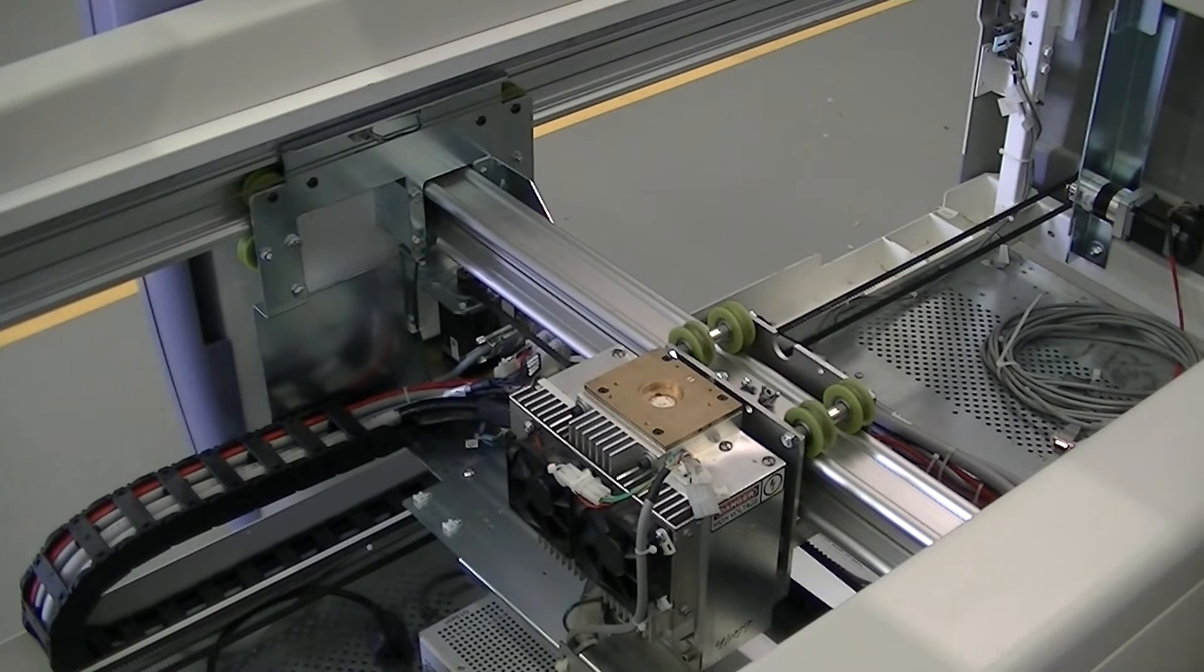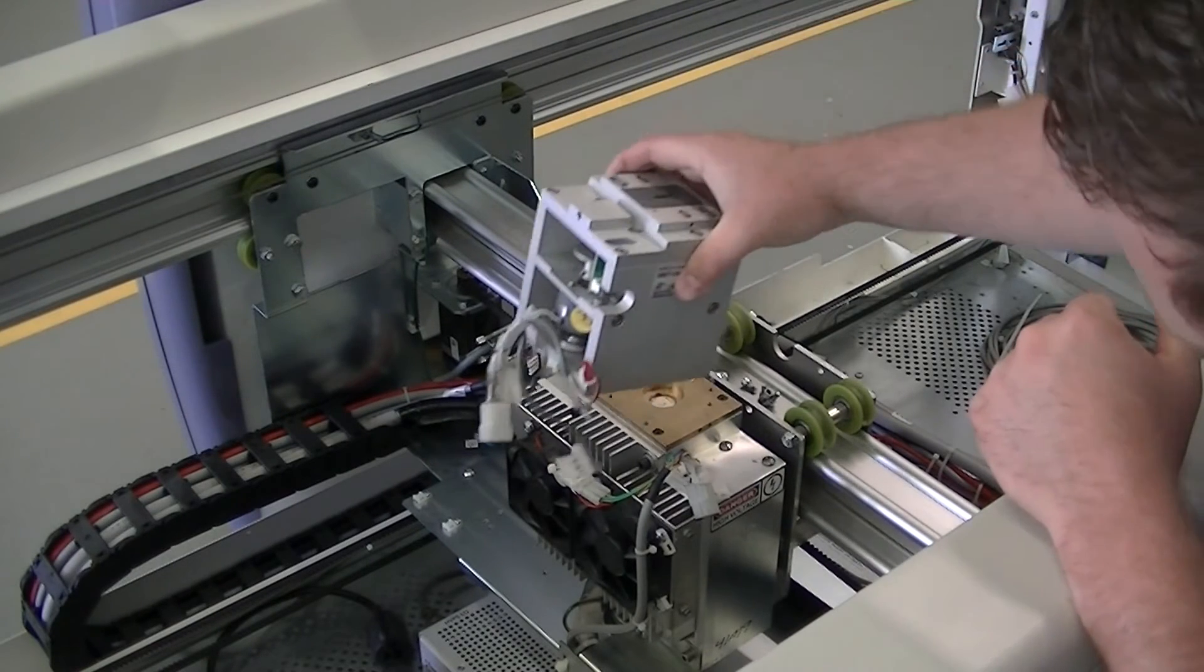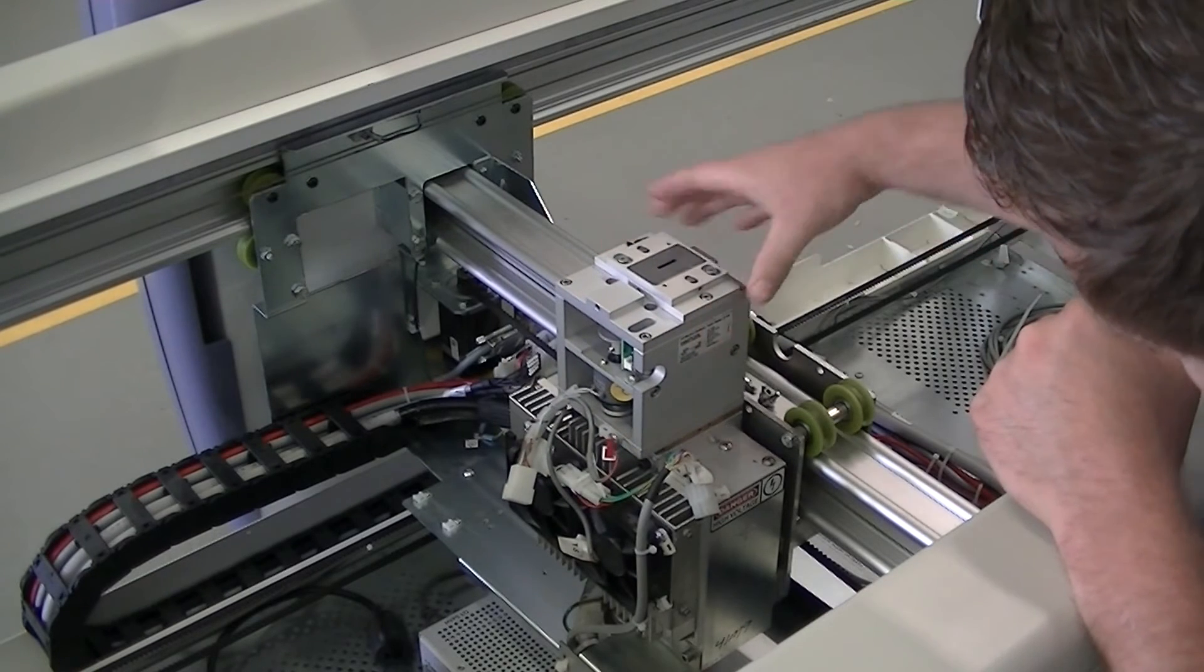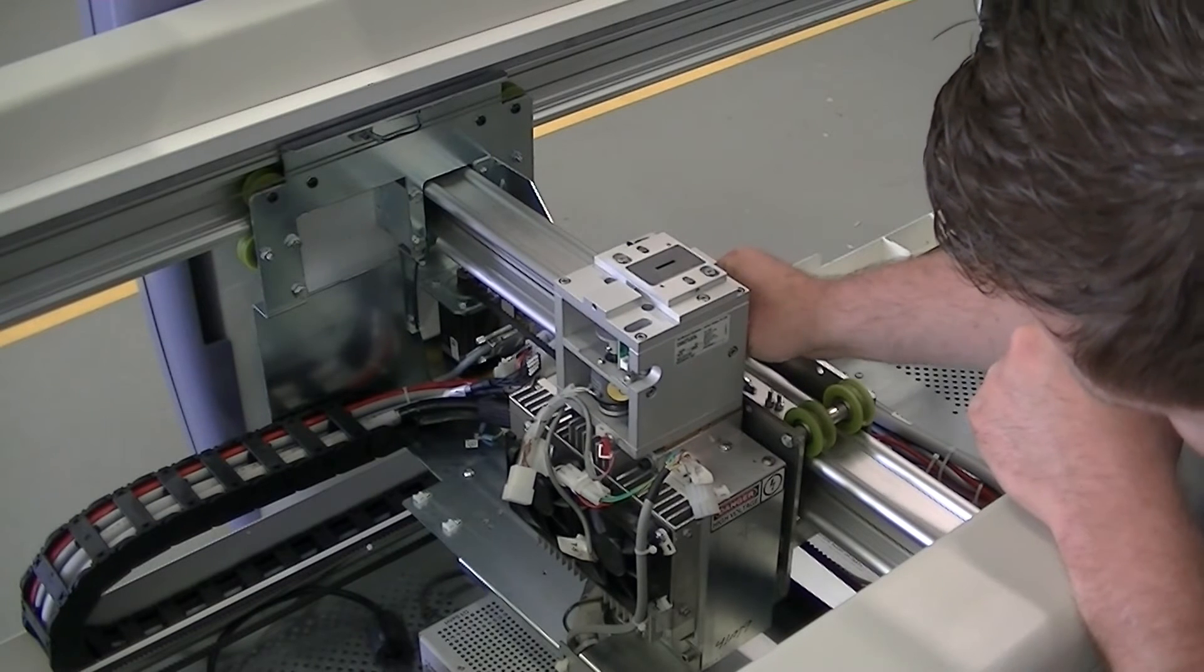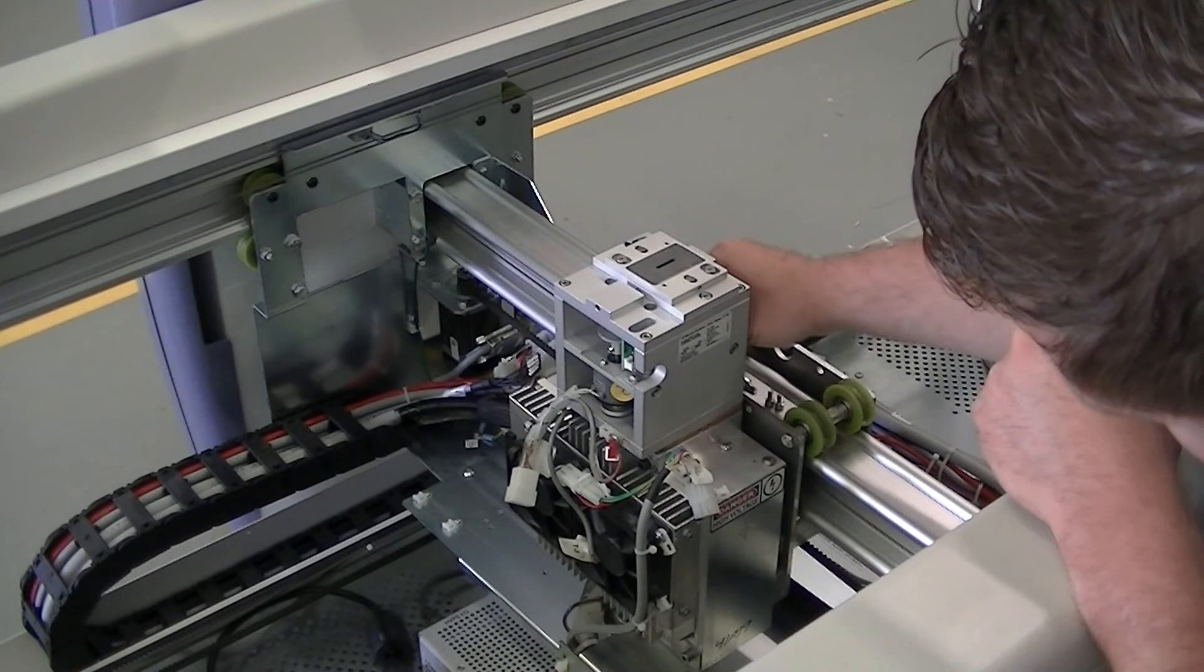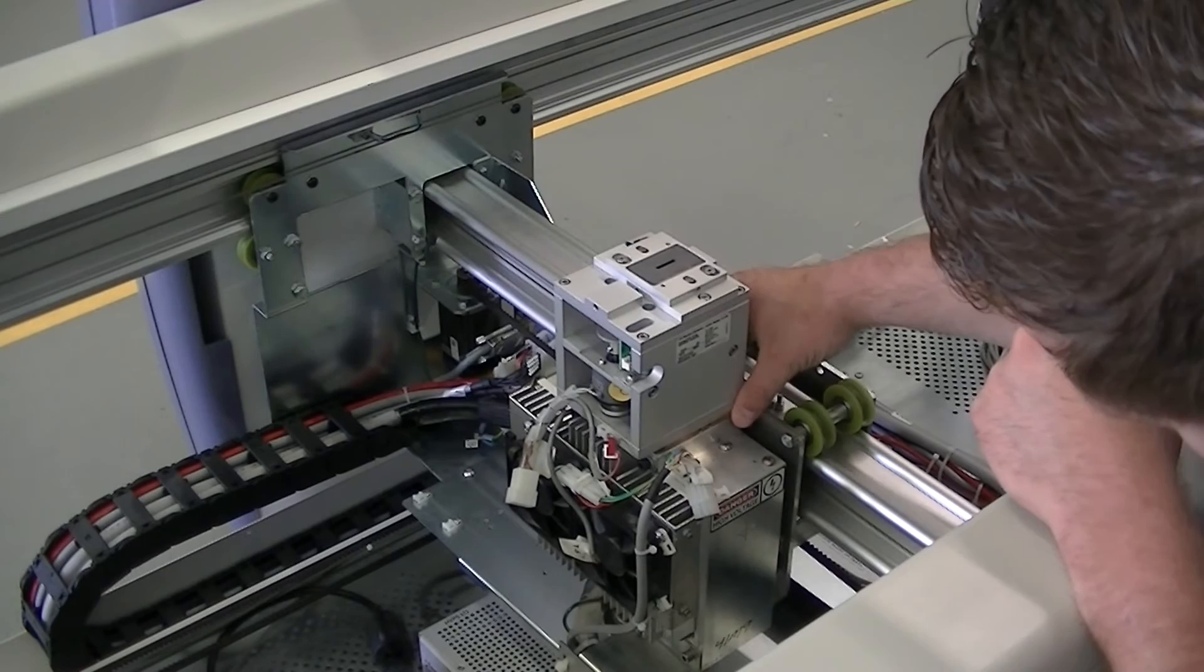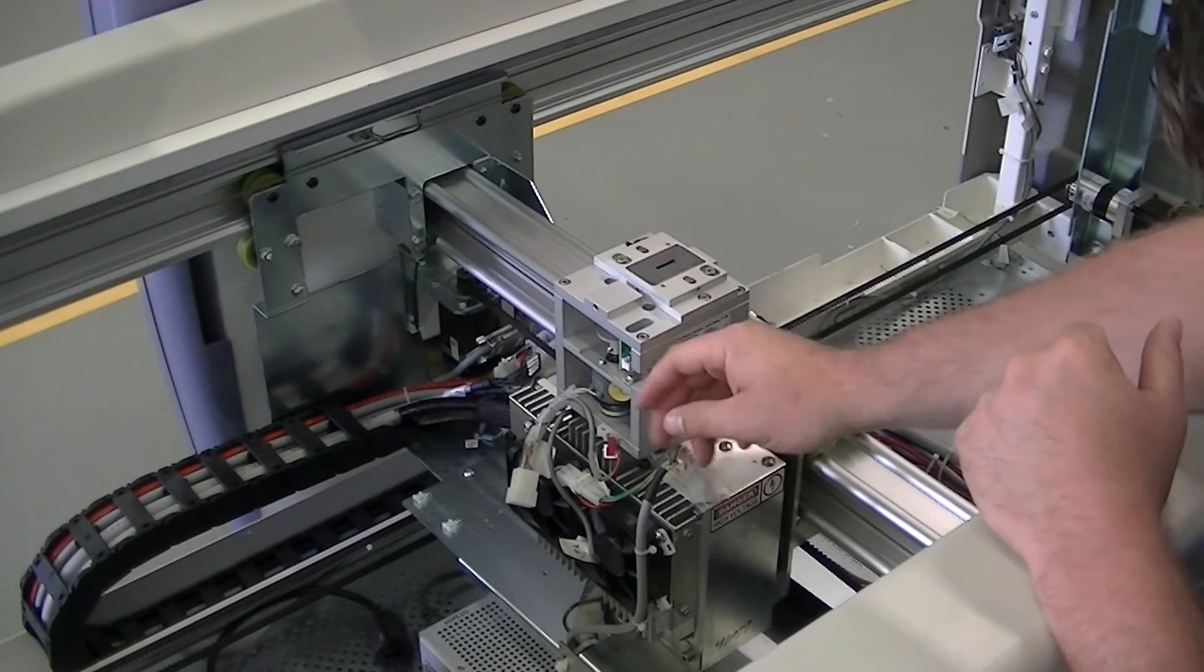After the tube has been verified that it's aligned, now we can put the collimator on. You do not want to put the collimator on until the tube head is actually aligned correctly. And then we want to hook up all the appropriate connections.